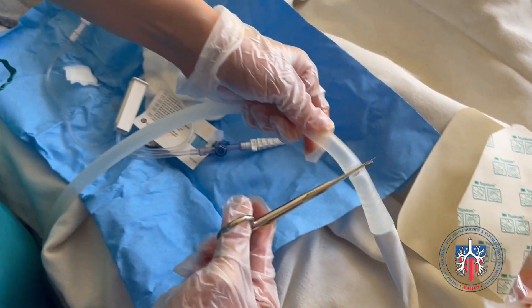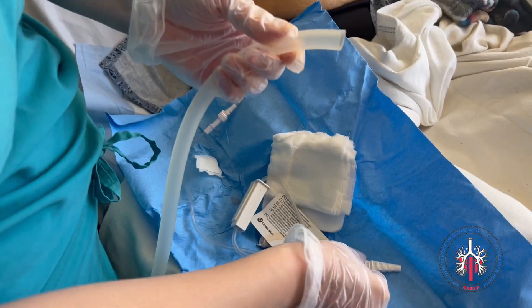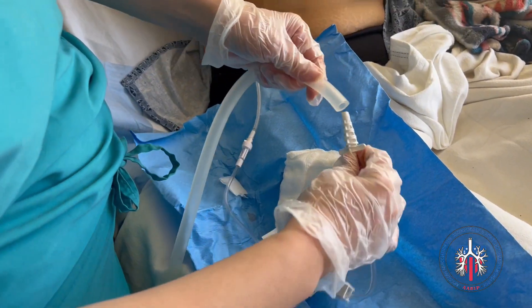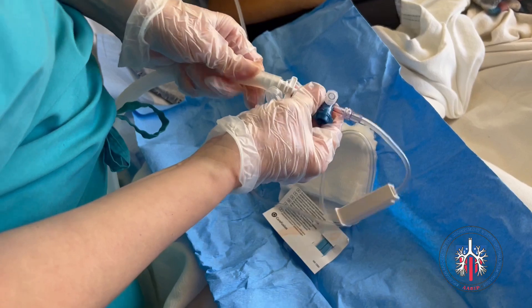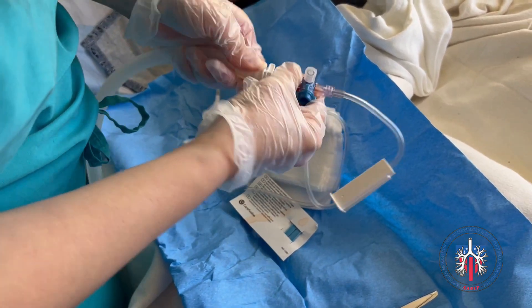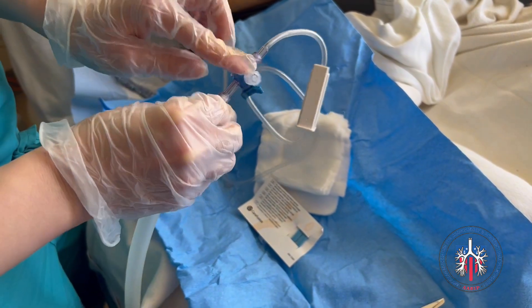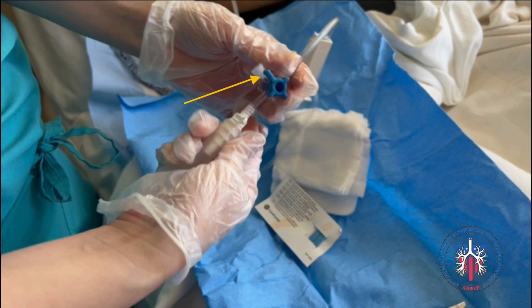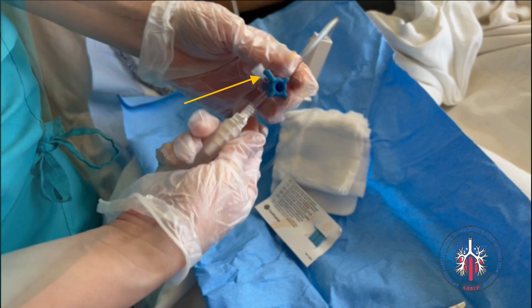The rubber tubing on the chest tube drainage system is cut and connected to the drainage line adapter. If a three-way stopcock is used, make sure the knob is pointed towards the perpendicular end so that it is in the unlocked position.